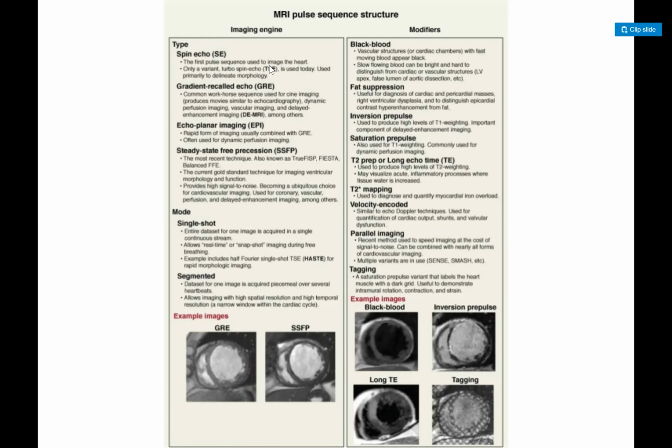But the issues, for example, pacemaker, you want to get a gradient echo in those patients, because gradient echo does not change a lot of sequence radio frequency, because in spin echo you might need 2 radio frequency signals, so it takes long. Gradient echo is quicker, and you might not magnetize too much, so there might not be much artifact from things. So gradient echo is really good in those patients. It's quicker, it takes less time. If the patient cannot take long breaths, then you can use gradient echo, and it will give you the same type of T1 and T2 imaging that you want.